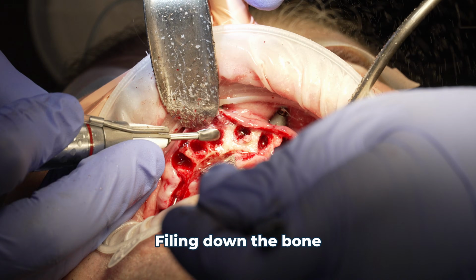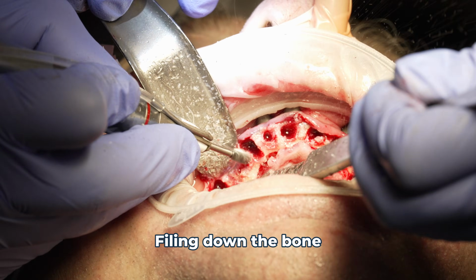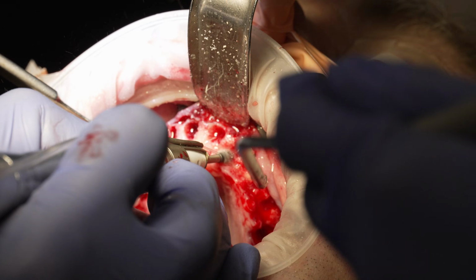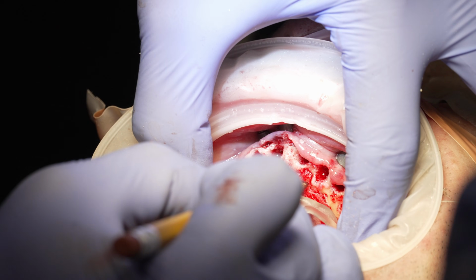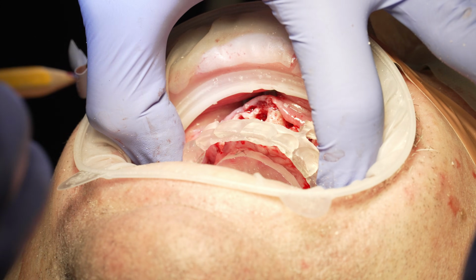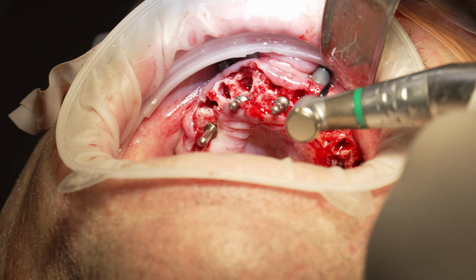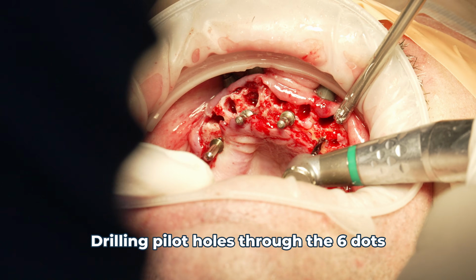So now we use that guide to start marking where we want to put the implants along that little slot that we made in the 3D guide. And so we mark each spot in pencil right where we want those implants placed. And so once we have those dots, you'll notice that we start to make 6 little pilot holes in the bone where those spots are, because ultimately that is where the implants are going to be as well.